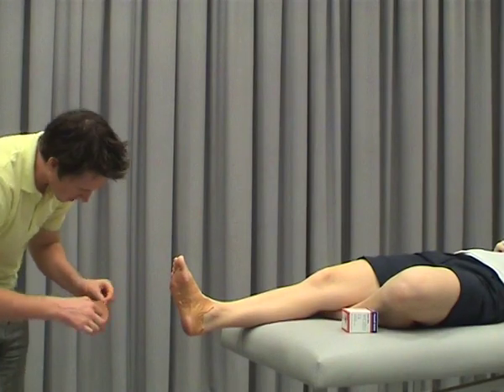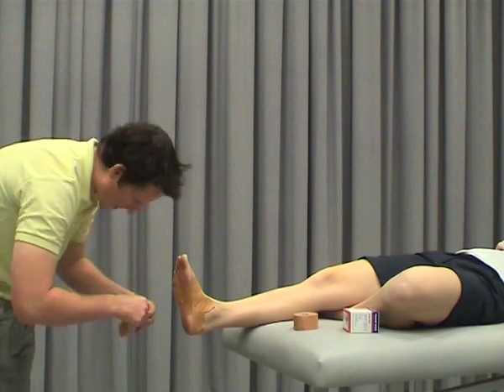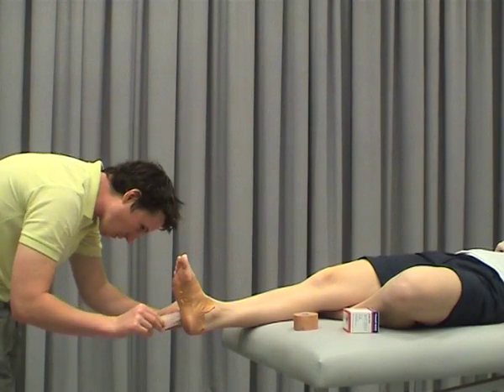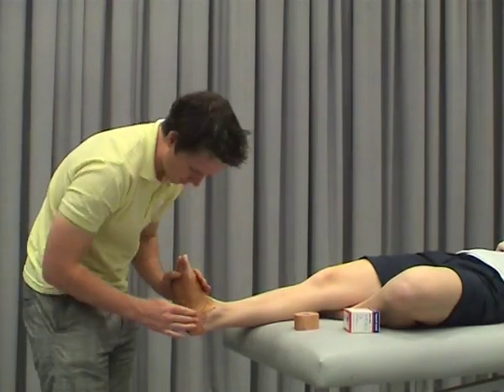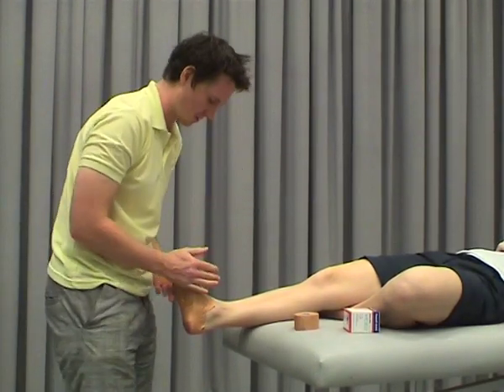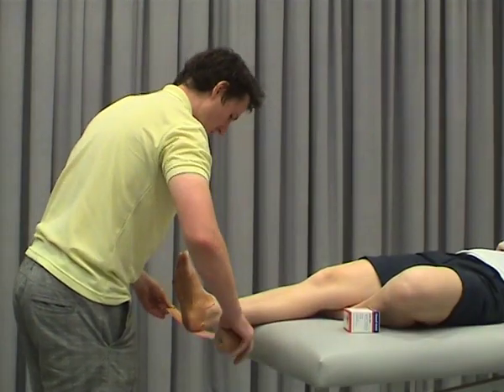You probably don't need to use strips as long as what I'm doing. Usually you use three to four or even five strips depending on the length of the foot, but usually overlapping about 50%. So that's our low dye, which we'll anchor back off again.